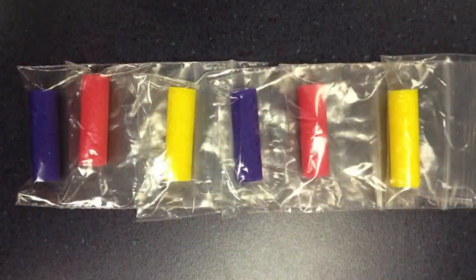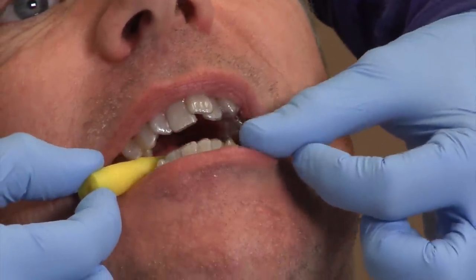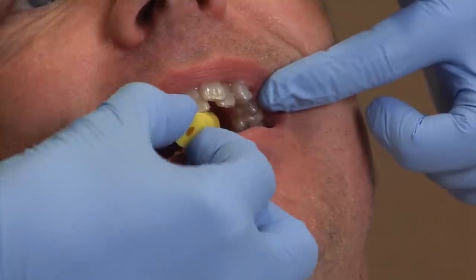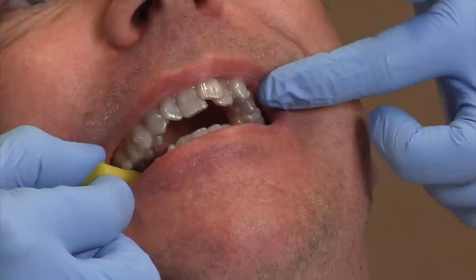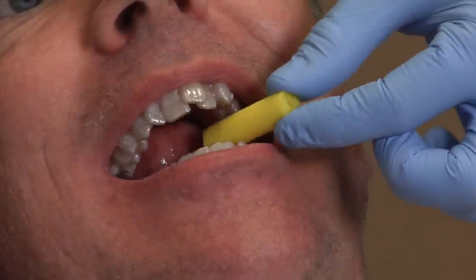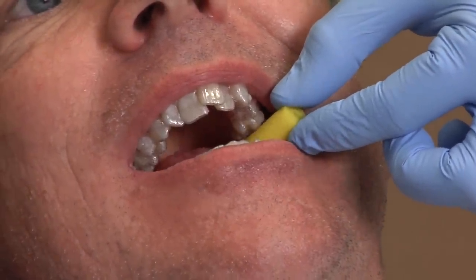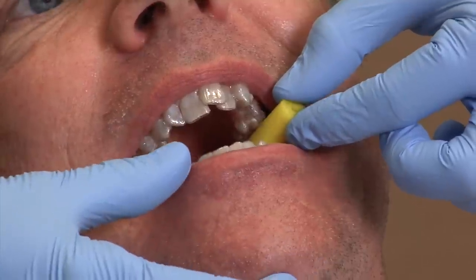For the first few days after you get your first aligner, and each new aligner you go into, you want to really encourage that tray to seat properly. You can do that by chewing one of these — we call them chewies. They almost look like a piece of thick rubber gum. You take the chewy and just bite down everywhere. You'll notice you might hear the tray crunch down, and this will really help seat it into its proper position. Chew these for about 15 to 20 minutes for the first three to four days when you start a new aligner.